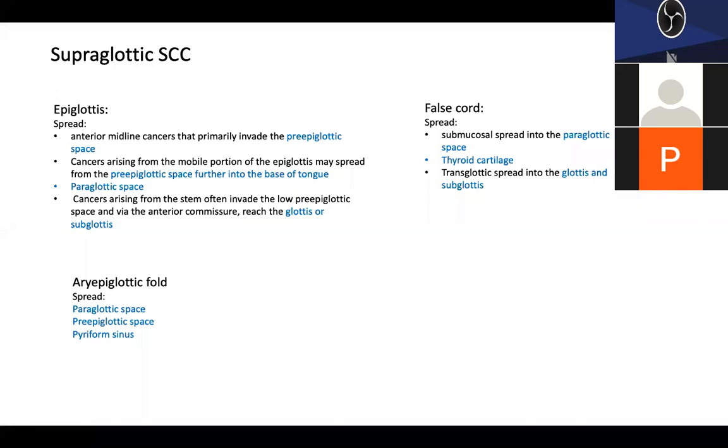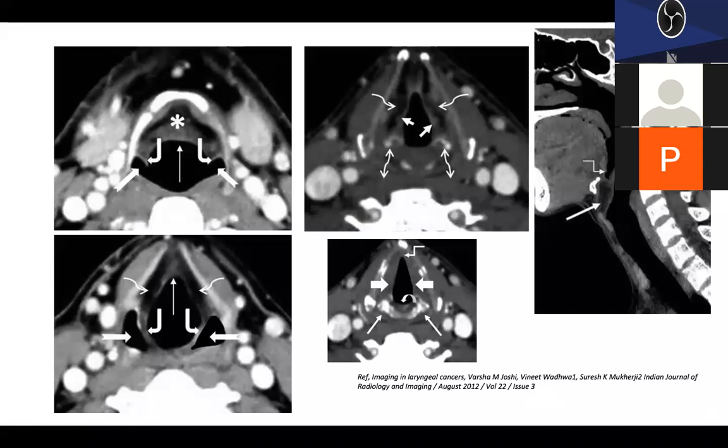I'll just hold this slide, and go to this other slide. Then we'll come back to the other slide again. So here is some basic anatomy, showing how we perceive these structures in cross-sectional imaging, the CT scan.